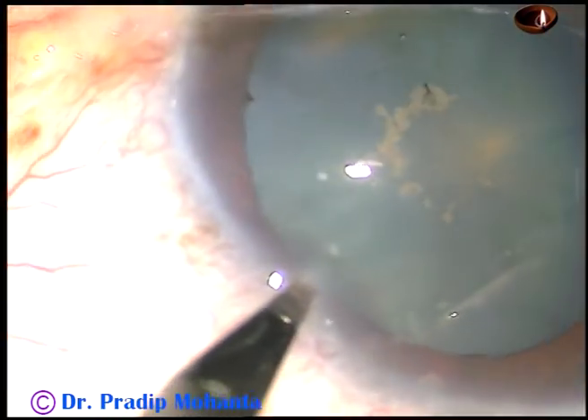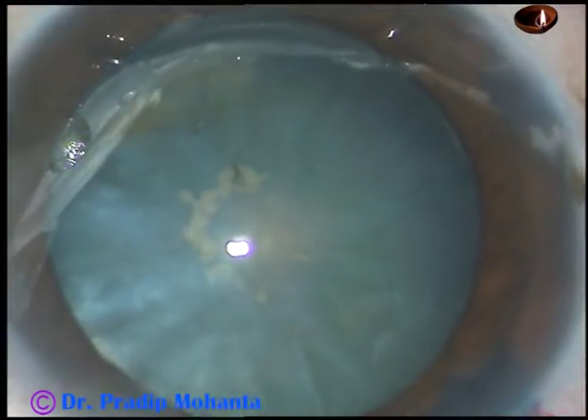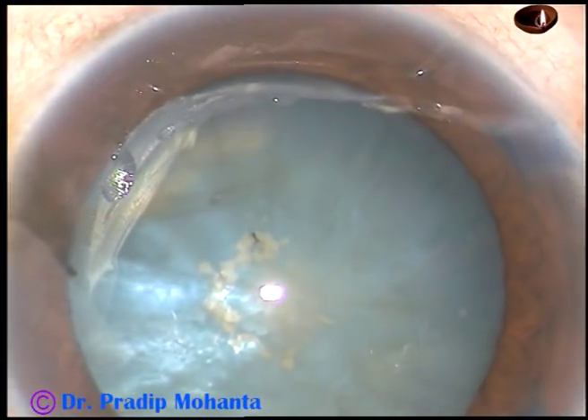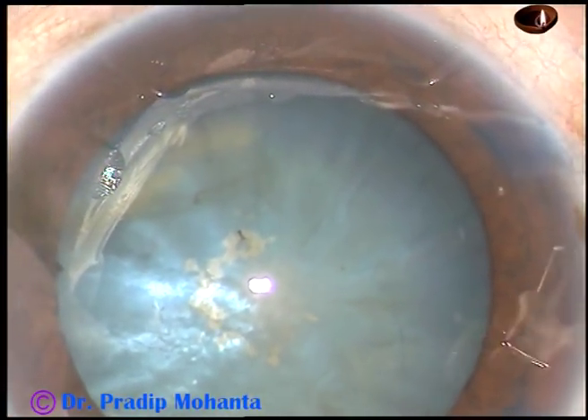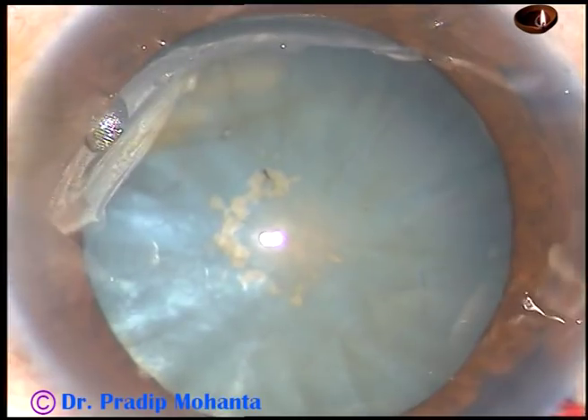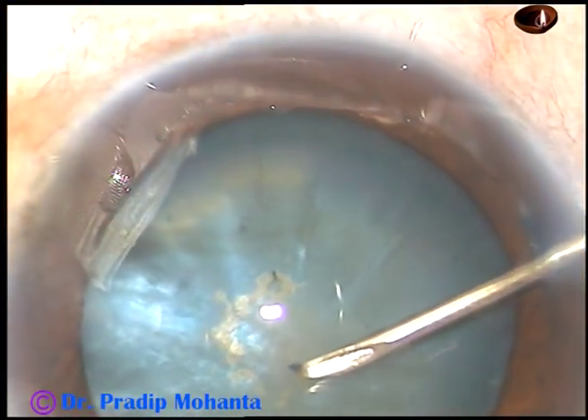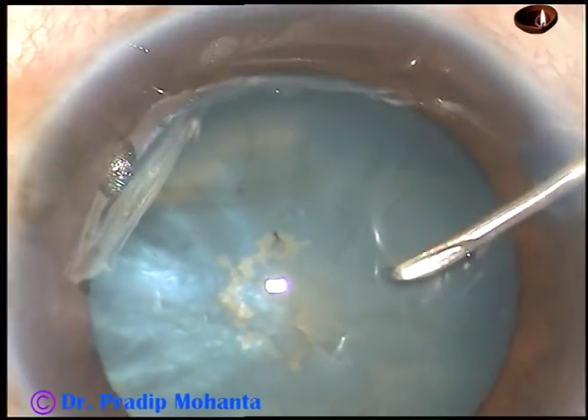Before that, this is a side port on the left side of the main incision. Now a 26-gauge needle is taken and introduced through the right side port. The anterior capsule is cut and a curved flap is made.